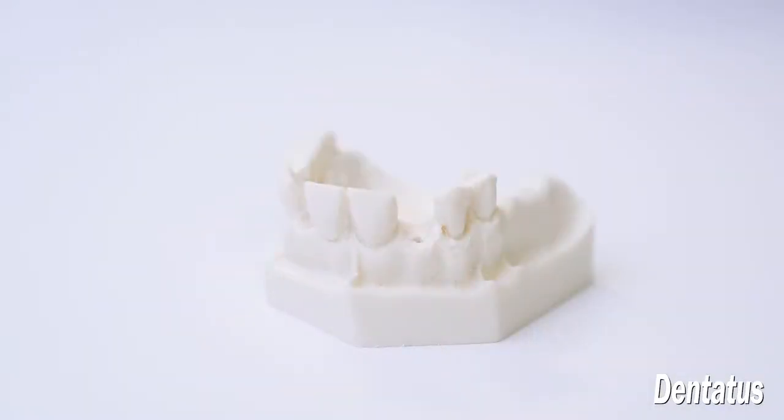Narrow implants allow dentists to provide more affordable, less invasive, faster procedures. But only Dentatus offers a screw routine system with prosthetic options for overdentures, single tooth, and full mouth reconstruction.